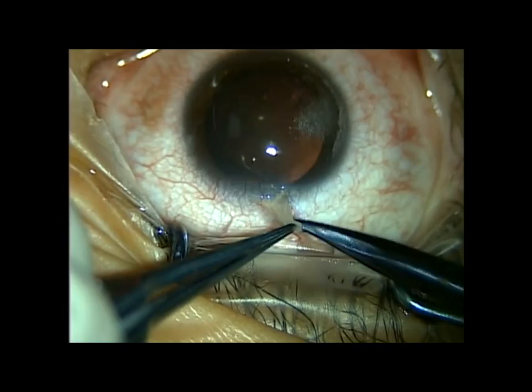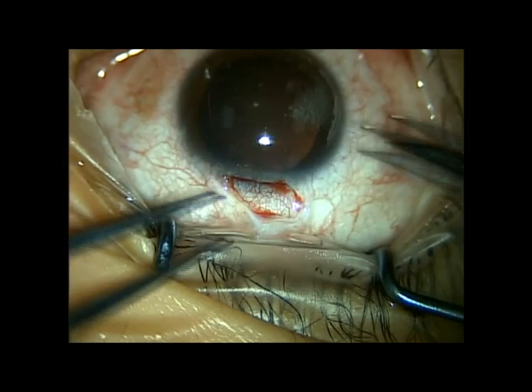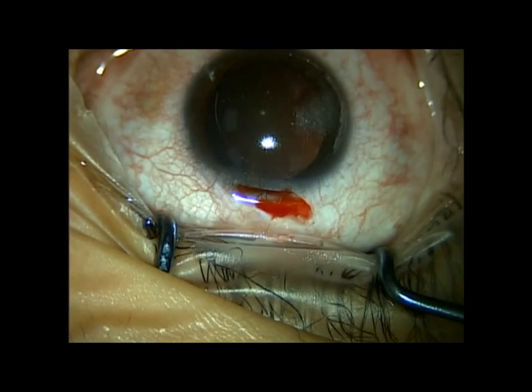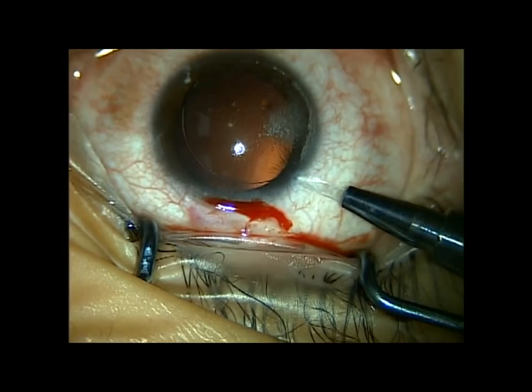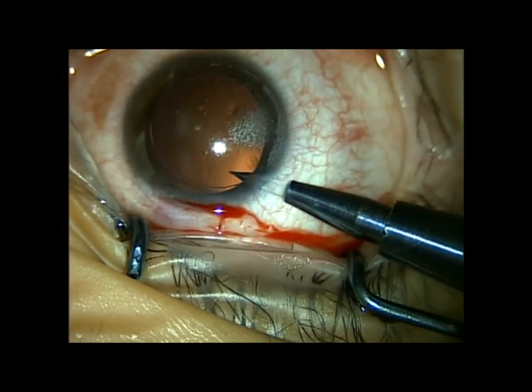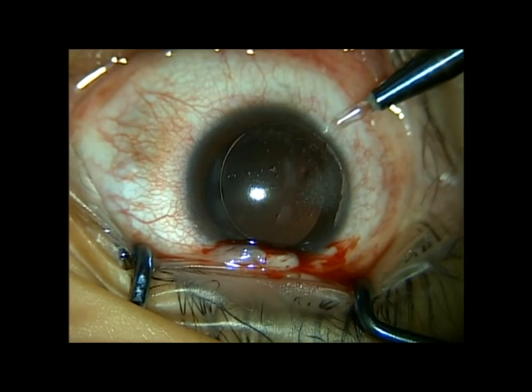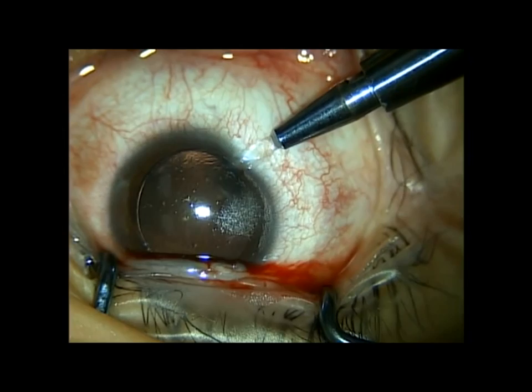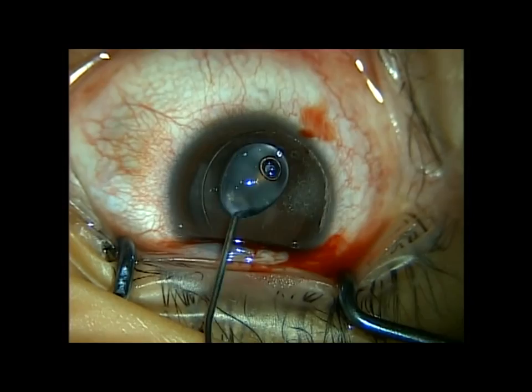This patient has a lot of astigmatism at axis 90 degrees — with-the-rule astigmatism. I didn't feel comfortable making an incision at the 180 degree axis mark because I didn't want to induce more astigmatism. So I elected to insert the lens at 90 degrees, hoping to reduce astigmatism just by my incision placement. This is topical anesthetic; the patient is on 10 milligrams of Valium. I make three entries into the eye — the first two I'm very careful with because there's no OccuCoat in the eye. This is a phakic gentleman with a clear lens, so I insert my sapphire instrument parallel to the iris plane so there's no risk of bumping the anterior lens capsule.